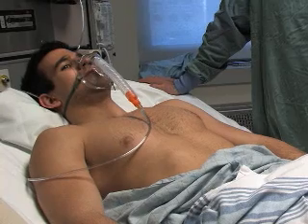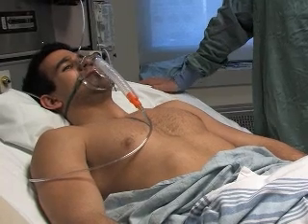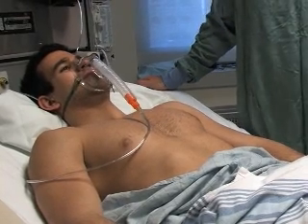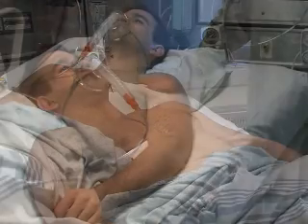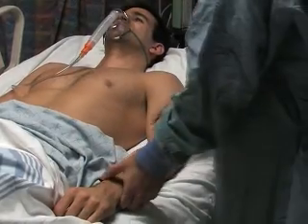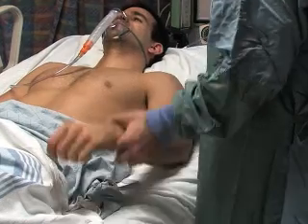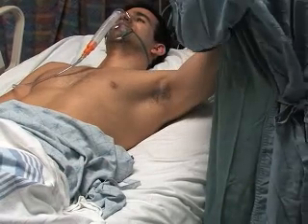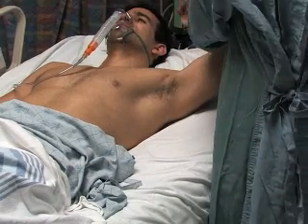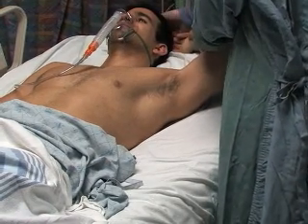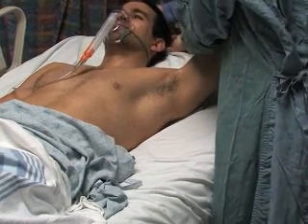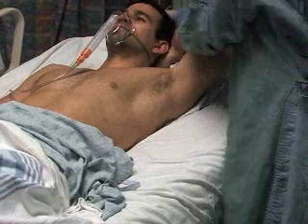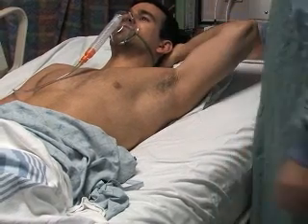The patient should be positioned either supine or in the semi-recumbent position. The ipsilateral arm may be maximally abducted to the side of the patient or, alternatively, positioned behind the patient's head, in order to have optimal exposure of the insertion site.